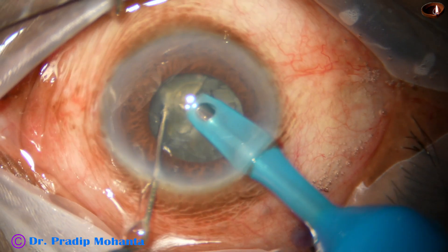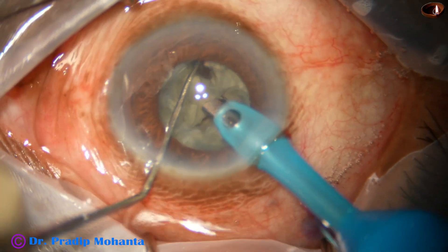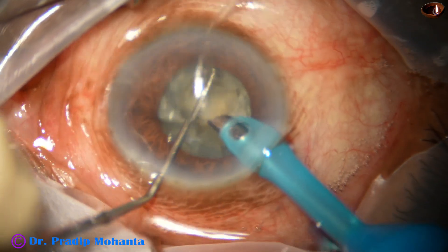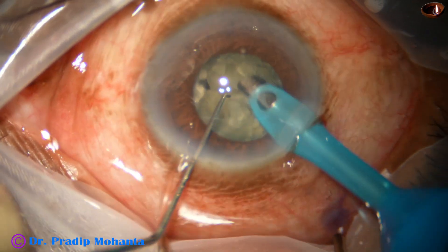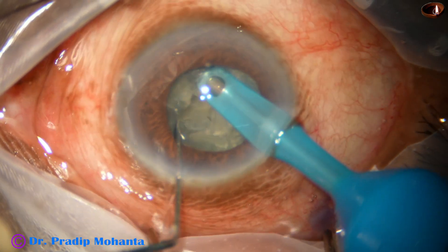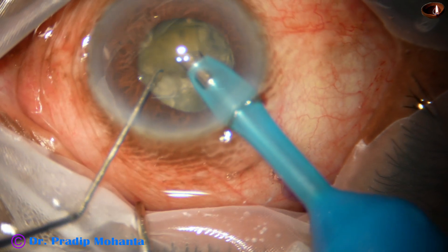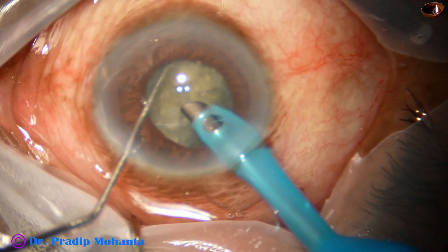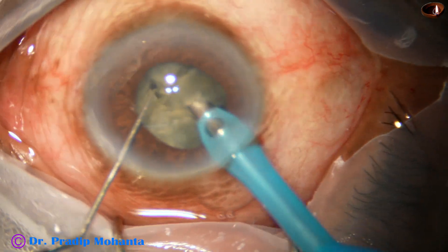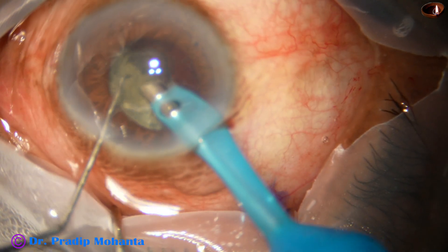In this case, I have kept the pupil sideways towards the right side. I'm trying to use the phaco needle tip as a wedge so that it goes into the substance of the nucleus easily. This is maybe a bit risky going to the periphery, but I had to get the base free. Once I get it, I emulsify it and then it becomes easier to move the other pieces.